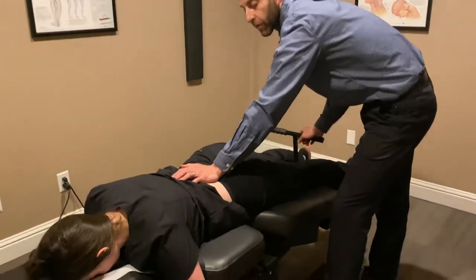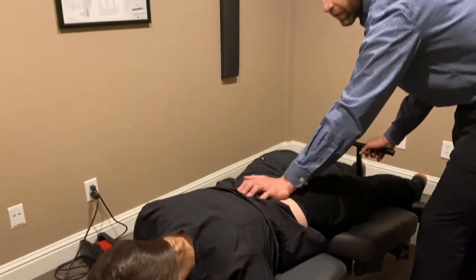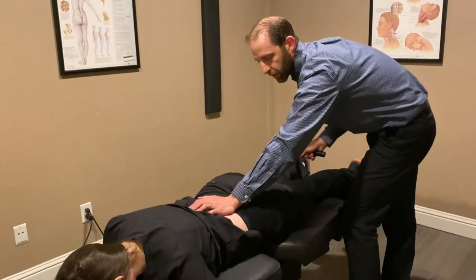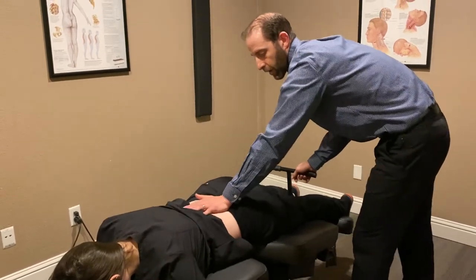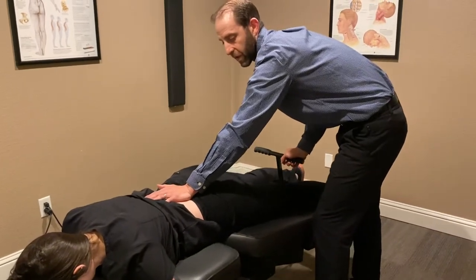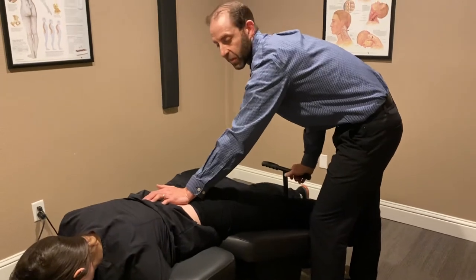So in lieu of doing a hard manual manipulation, we can just gently migrate the table into flexion and a little bit of lateral flexion off to the sides, depending on what their needs are. This can be used for as little as a few minutes, or we can put a patient on there for 15 to 20 minutes with stim.